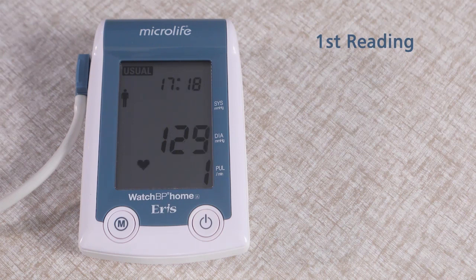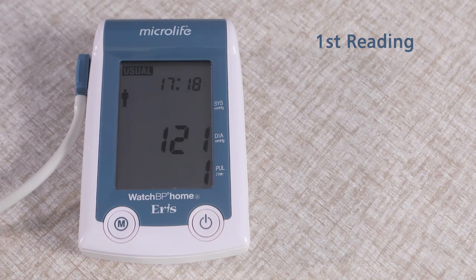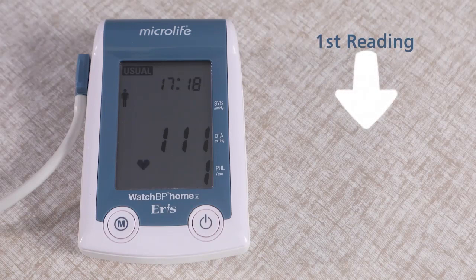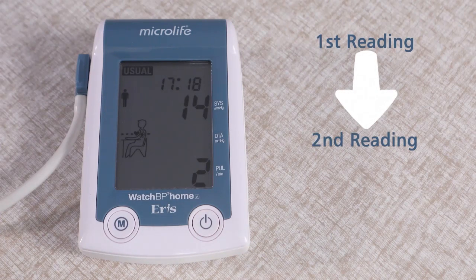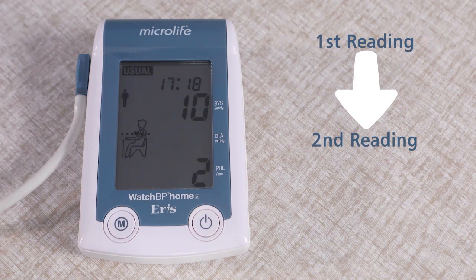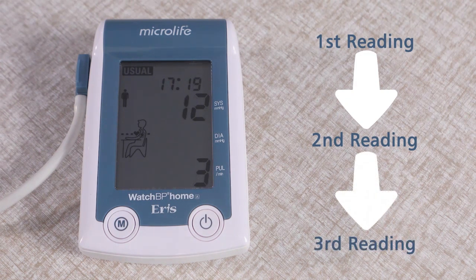Continue to sit in the same position. After 15 seconds, the machine will take your second reading with the cuff compressing and deflating again. The same procedure will be repeated for the third time.